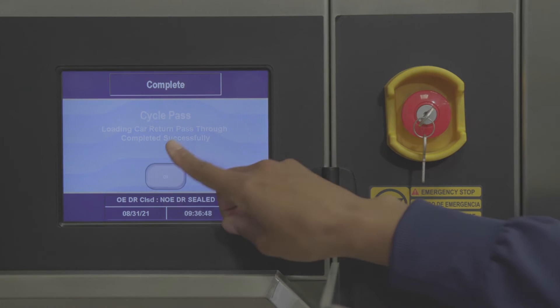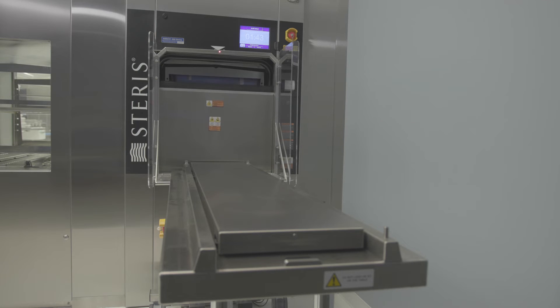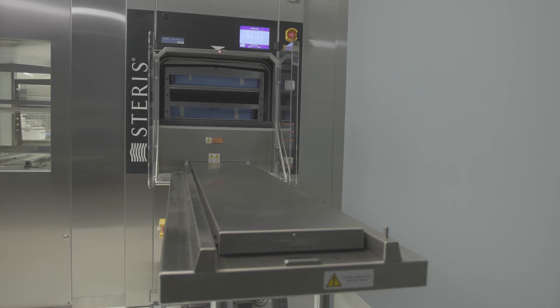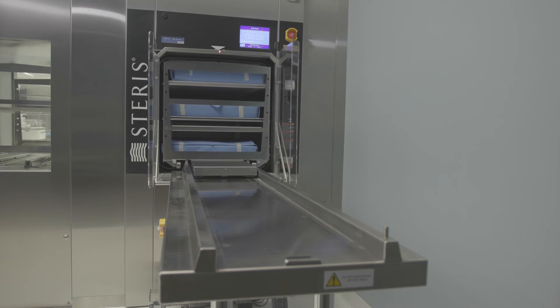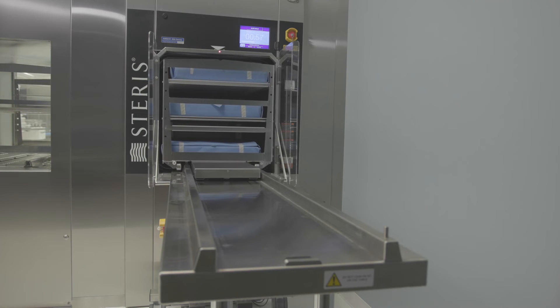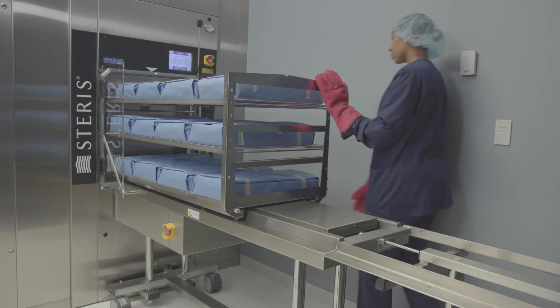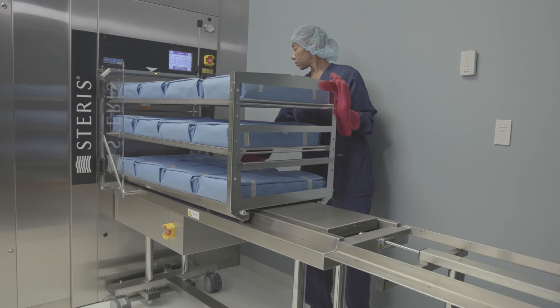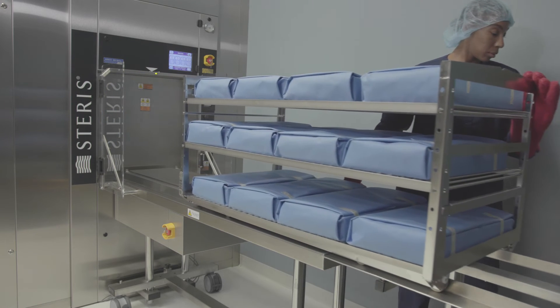When a cycle is complete, the sterilizer automatically detects if a sterilized load is on the unload table. If the unload table is empty, the unload side chamber door opens and the system automatically unloads the newly processed instruments from the sterilizer. Sterilized loads should be removed from the table to a cooling area away from air conditioning ducts, so the next loading car can be unloaded promptly upon cycle completion.